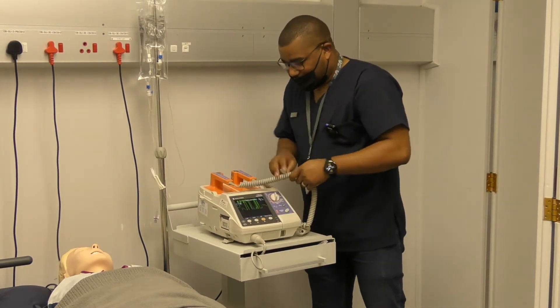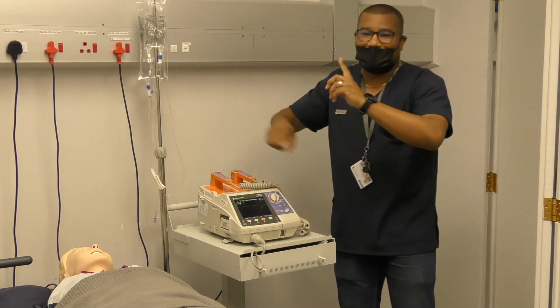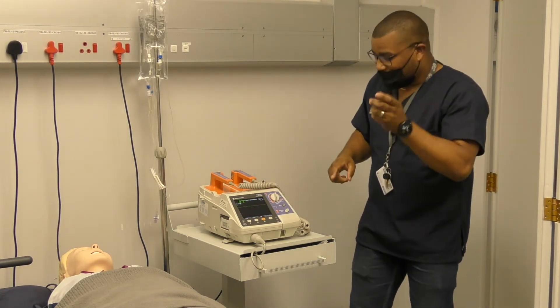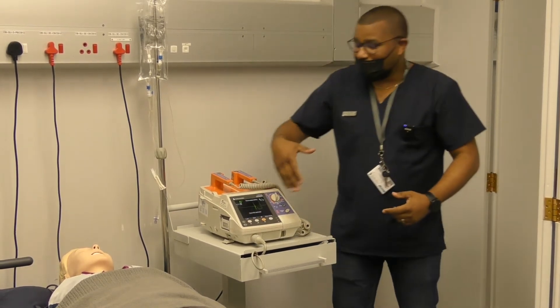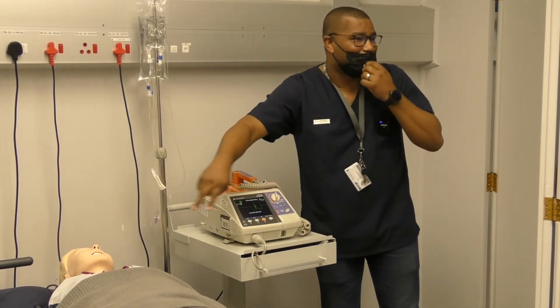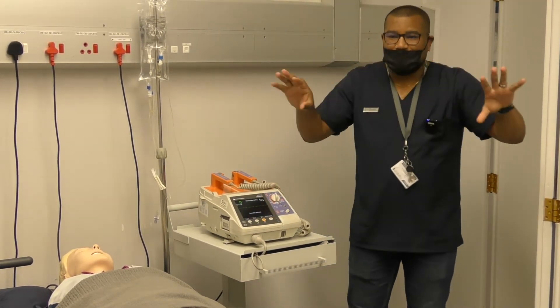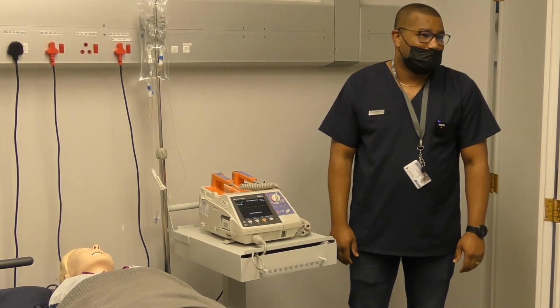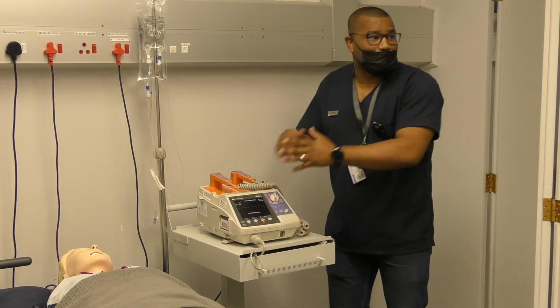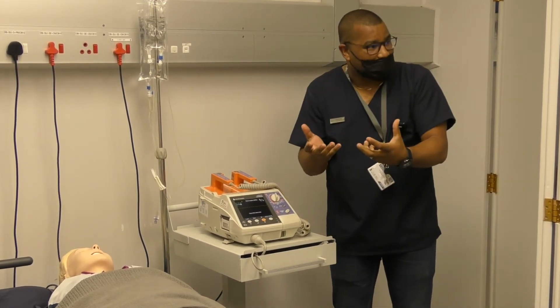Should you wish to switch between devices while in monitor mode, you press the lead button — that will go to lead one. But because no leads are attached to the patient, it won't give you any rhythm. For normal monitoring purposes, we always have our ECG on lead two.